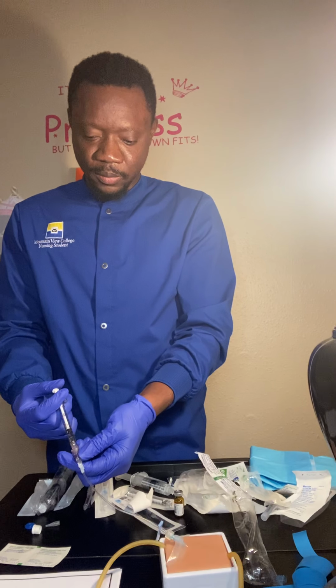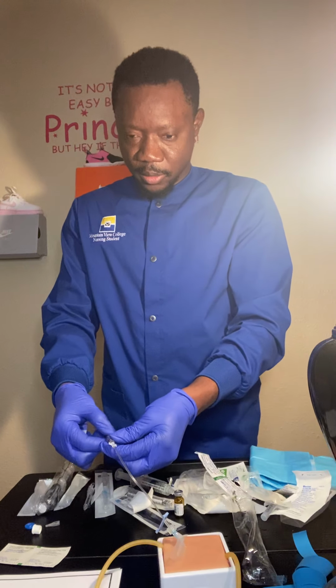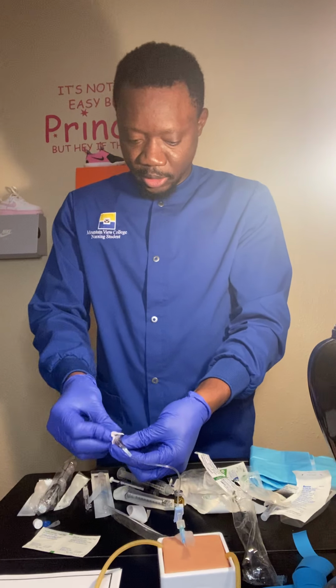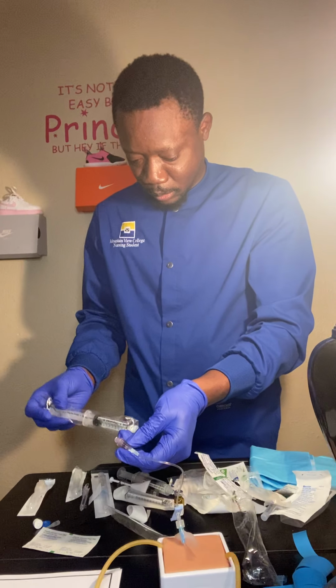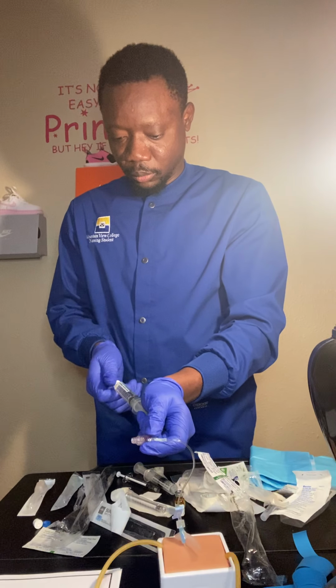So once I'm done giving my medication, I will unscrew it with a new alcohol prep. I'll clean it. And I'll get my new normal saline.